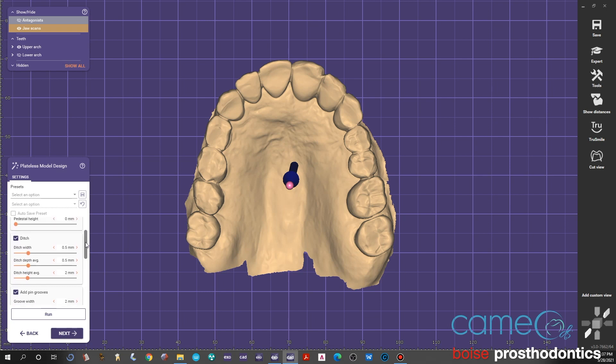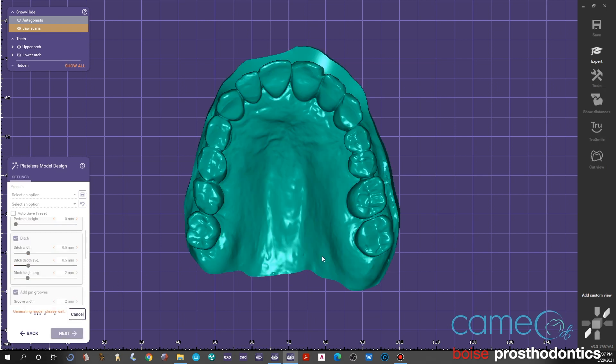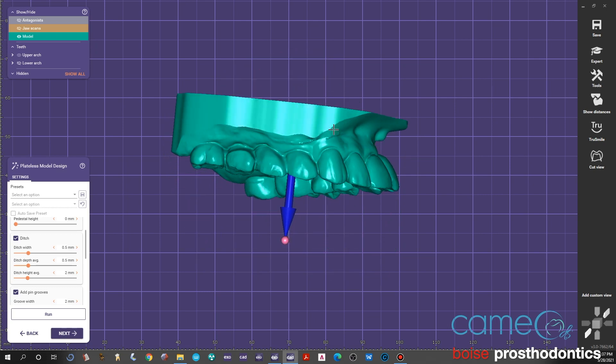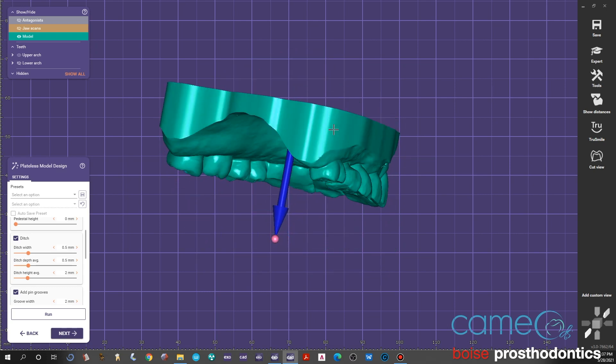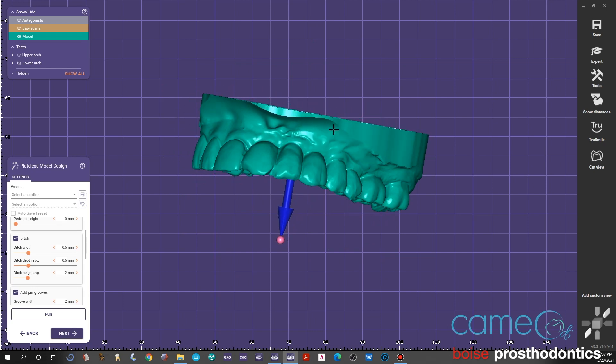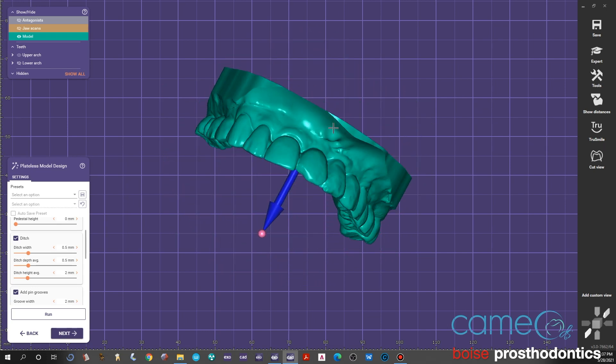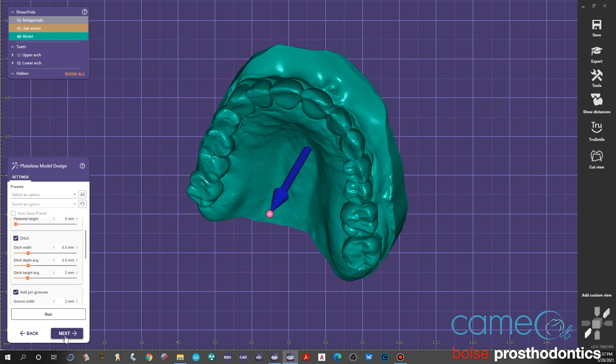You hit run and it'll calculate it, and now you have a 3D model. You'll see how it built the base up to that predetermined height at the very beginning in the occlusal plane setting.